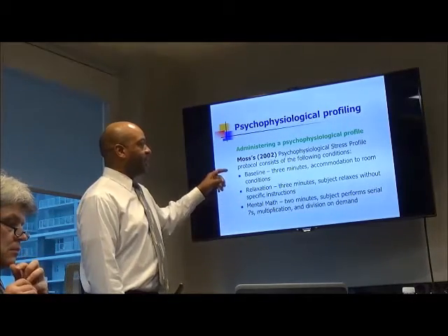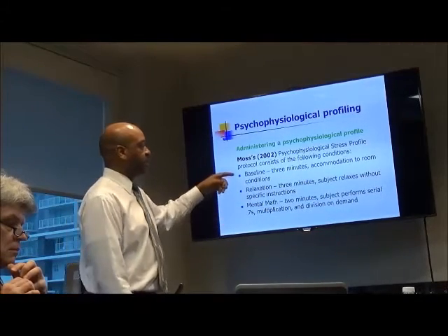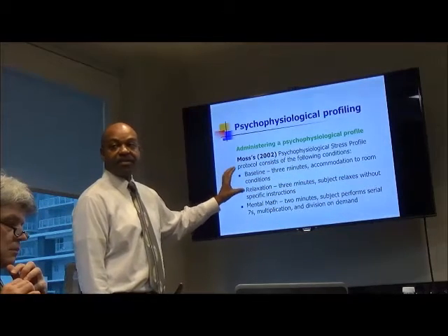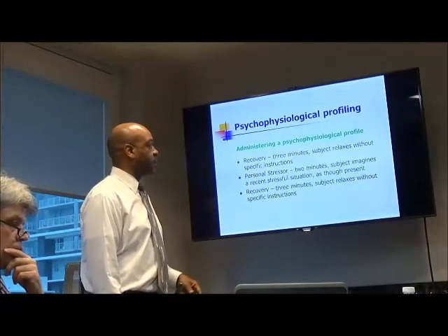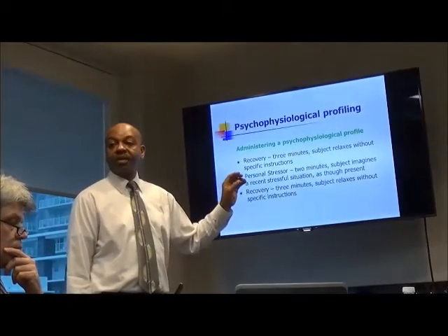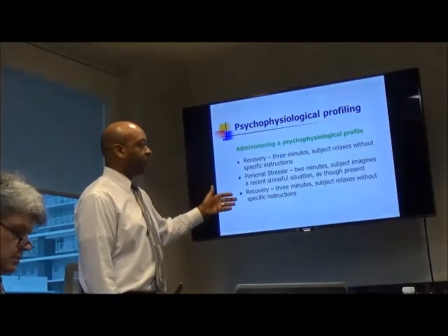stressor. In the software that Thought Technology has, the built-in stress assessment doesn't do both of these. It doesn't do a baseline and a relaxation. It just does a baseline, which I guess would also count as the relaxation in the beginning. Then you have a recovery, and instead of 3 minutes, they're using 2 minutes. So you have your recovery, then you have a personal stressor, another recovery.